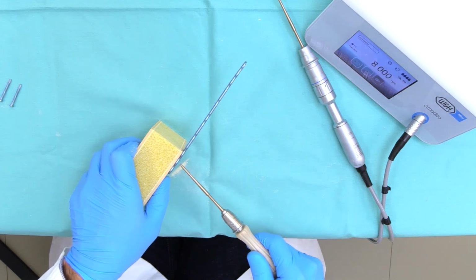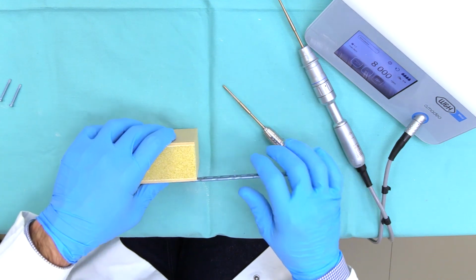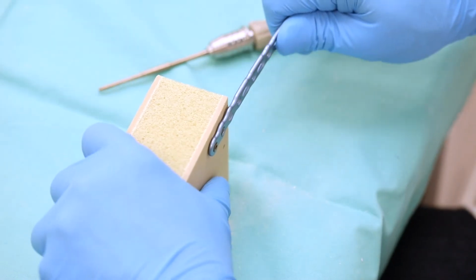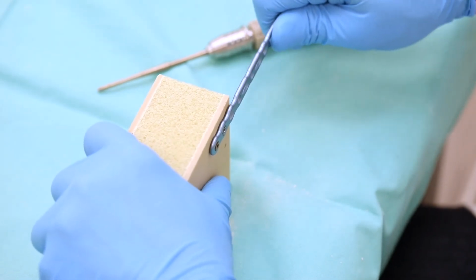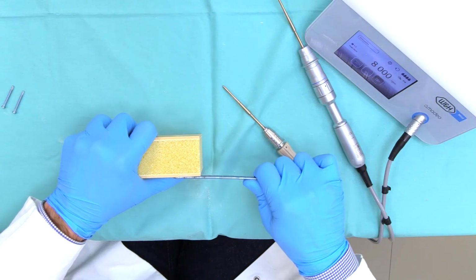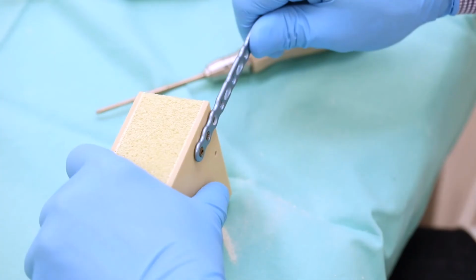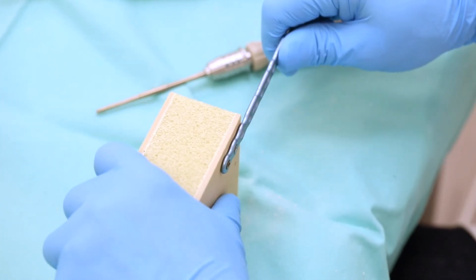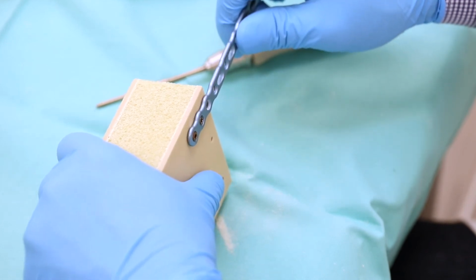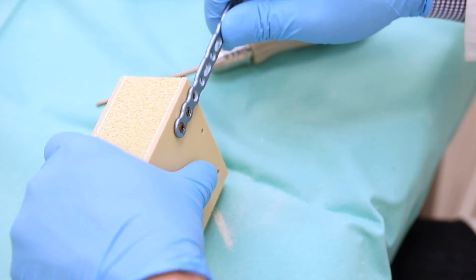It is essential not to overcompress these screws. If you do repetitive motions, the plate is better fixed to the osteoporotic bone. Therefore, it is advisable to use these kinds of screws and this kind of fixation in osteoporotic patients.